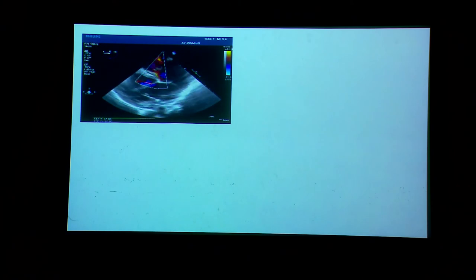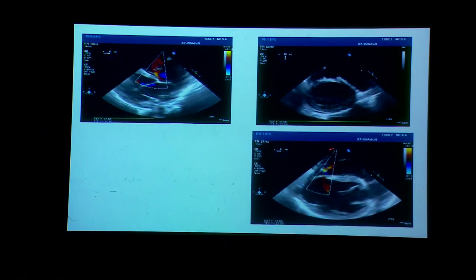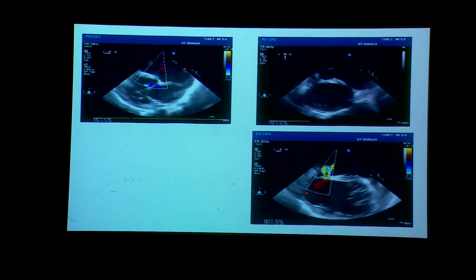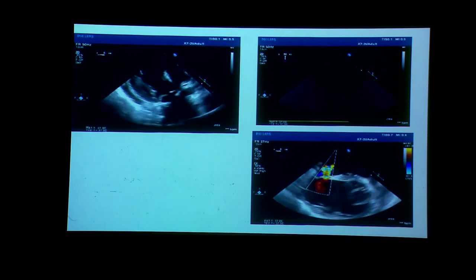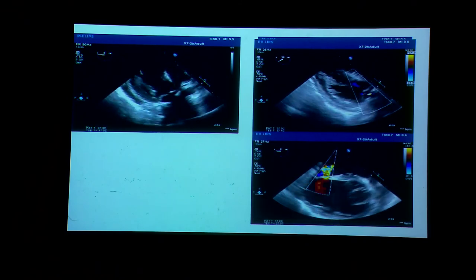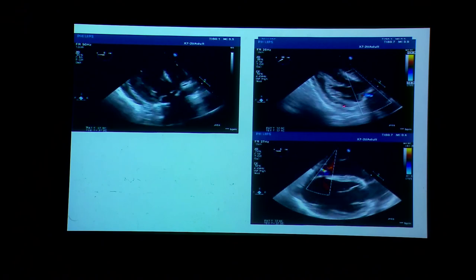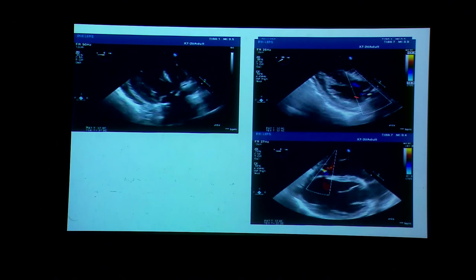These are the images you get — the image goes up and down with the cardiac cycle. This particular patient had an anterior tricuspid leaflet tear because a cardiologist attempted to close a post-MI ventricular septal rupture with a device and tore the anterior tricuspid leaflet. You can clearly see flow across the septum. For septal assessment, epicardial echocardiography is excellent because it is directly perpendicular to the septum. For mitral valve repair assessment, we can obtain four-chamber and five-chamber views from the LV apex position and evaluate the result after coming off bypass.